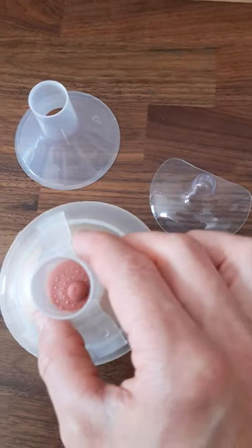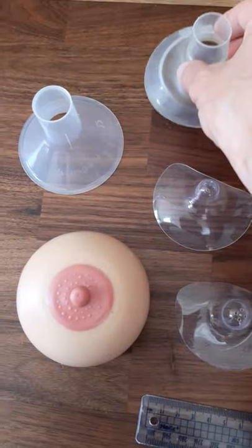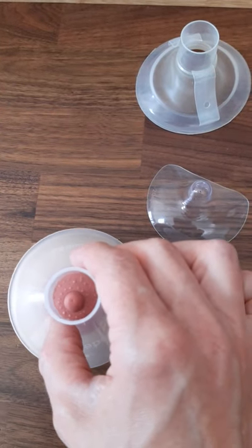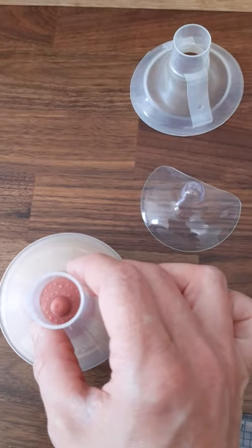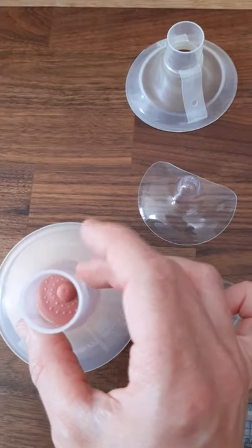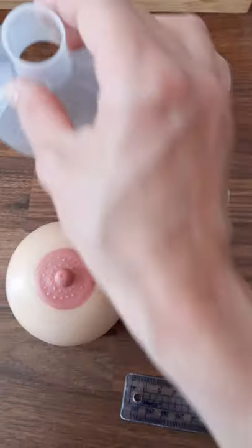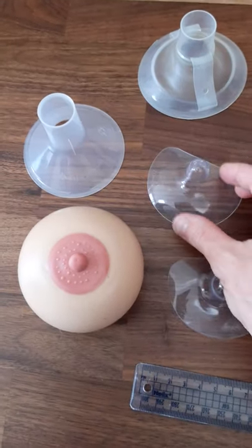To figure out which is the right size pump shield for you, you can try out different sizes and see whether your nipple is moving freely back and forth inside the funnel, not rubbing against the inside of the funnel — then it would be too small. If the areola is drawn in, it'll be too large.